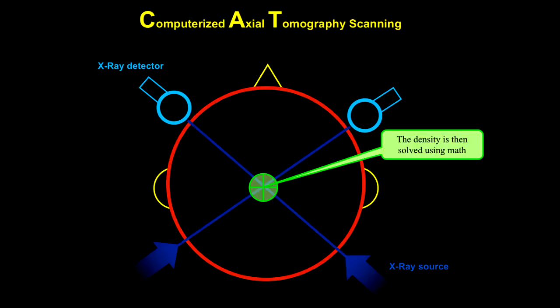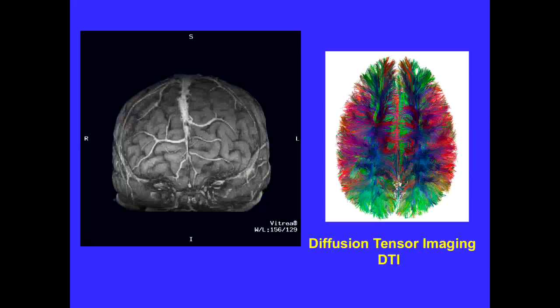And it's really just an upgrade of a regular x-ray. The x-ray has a source and a detector, and in CT scan, you just get lots of sources and detectors. You spin the ring around the head and acquire all kinds of data. Then you figure out exactly what density, from every projection angle that we might get, solves for the bone density, let's say, of my pinky, if that's what you were imaging. In our case, we're usually imaging the head, but you can image many things with CT.